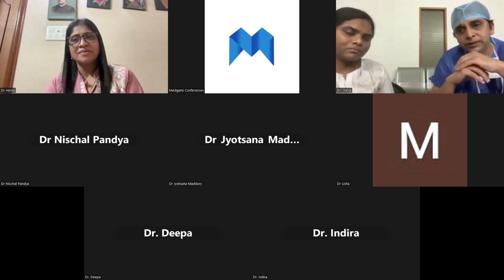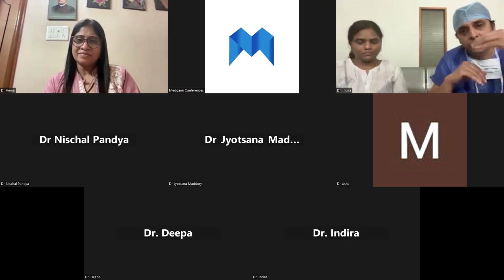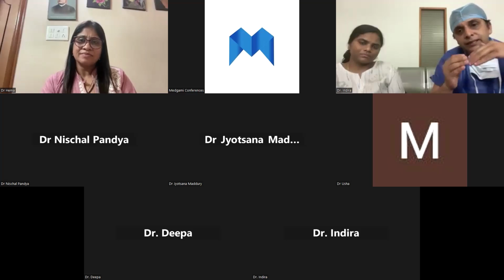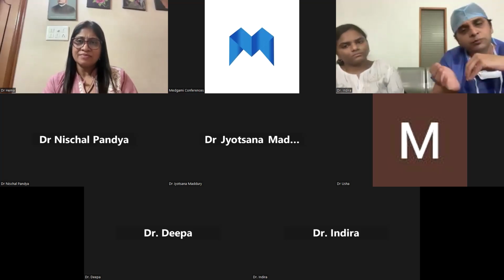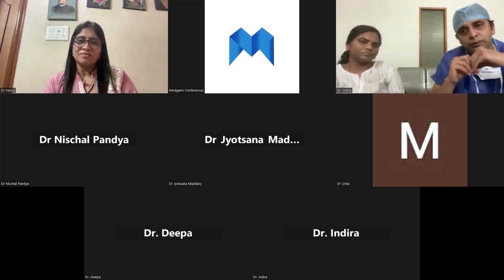Coming to the rims, I think most important for you would be the posterior rim and the inferior rim, because anteriorly you will always find a rim, except superiorly. Anteriorly, yes, the rims usually are thick, but the inferior, the IVC portion, and the posterior portion, those rims are quite important for us, and they're almost always very flimsy.